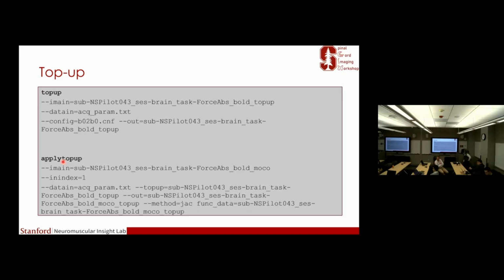But because our TR is 2.5 seconds long, I found that sometimes the physiological noise in the spinal cord, the breathing cycle, kind of changes after 1.5 seconds. So then we switched to odd and even in the brain, then odd and even in the spine. But you can do whatever you want if you have a justification.